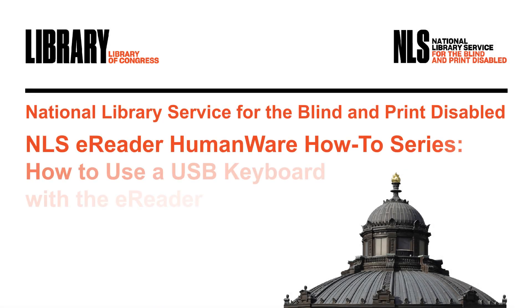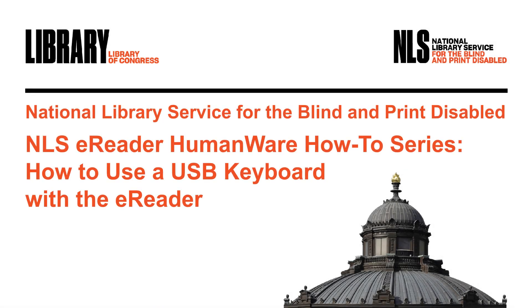NLS eReader HumanWare How-To Series. How to use a USB keyboard with the eReader. Hello, I am Judy Dixon. I work in the patron engagement section at NLS.